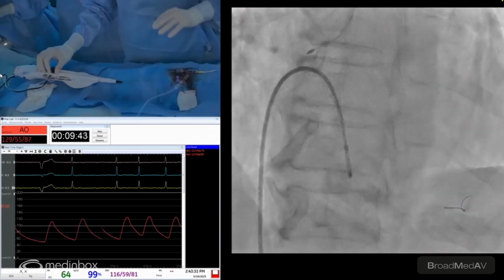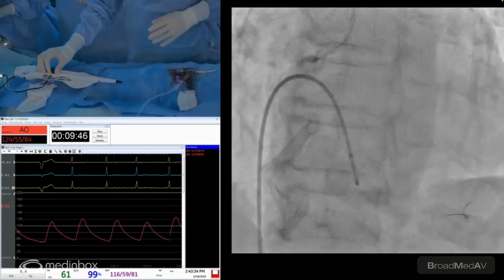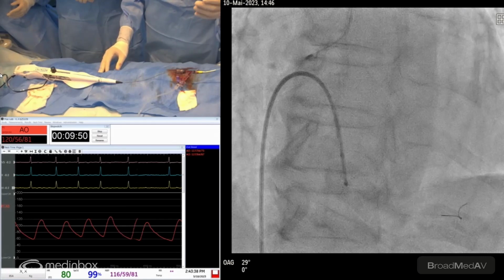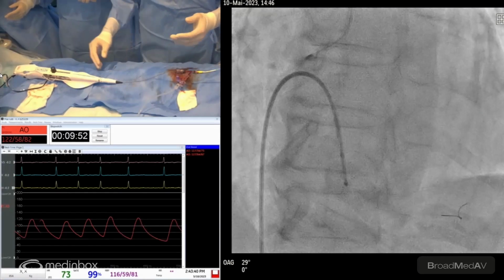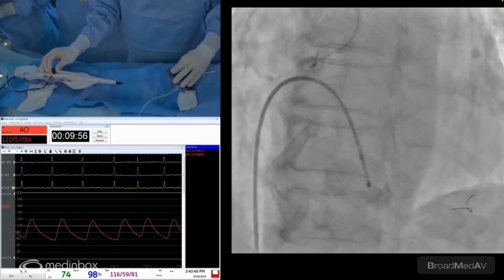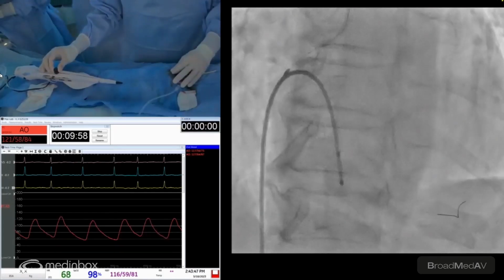So we have a pacemaker. We're not worried, but I still want to know, because if I get bradycardia, that means I've had higher chances of no reflow. Right. So let's go. First I'll start with a pecking motion, and then you listen.